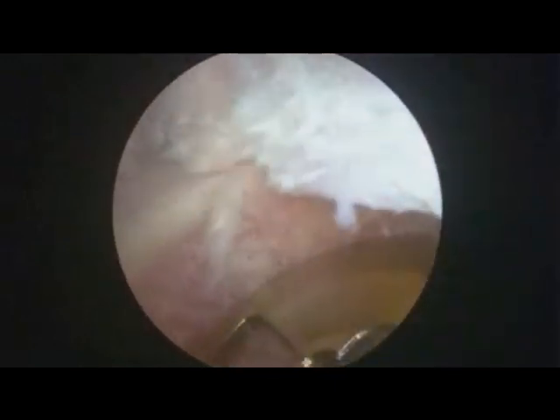So, foot pedal. Suction. I just want to clean off any debris, make sure that there's nothing that's going to prevent the implant from going down into position. So I just want to clean off the edges of my hole there.